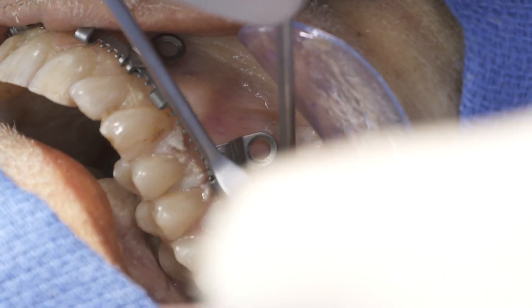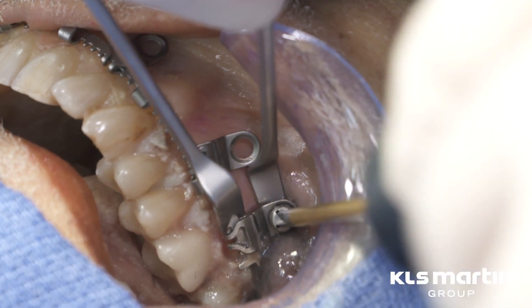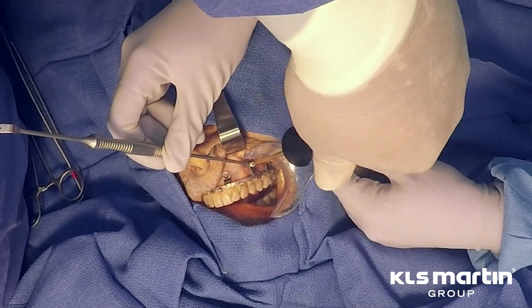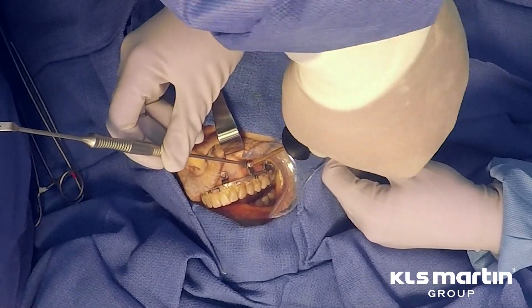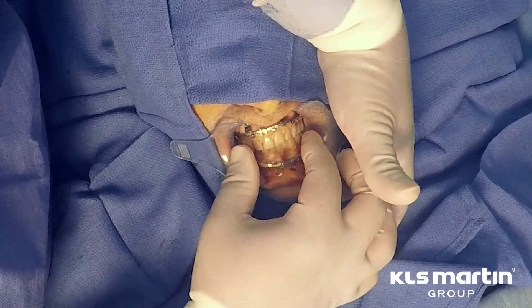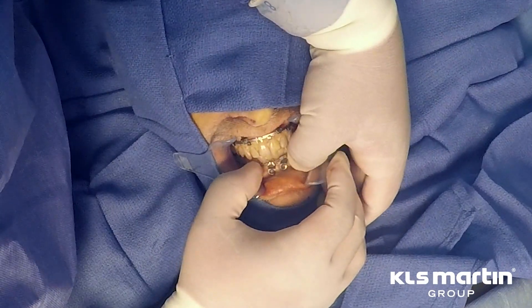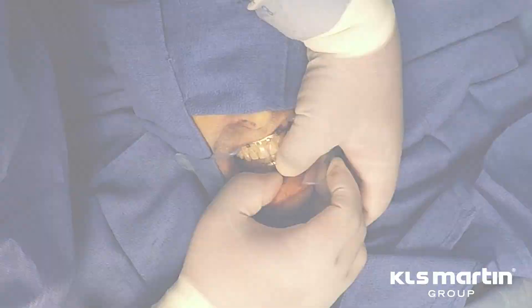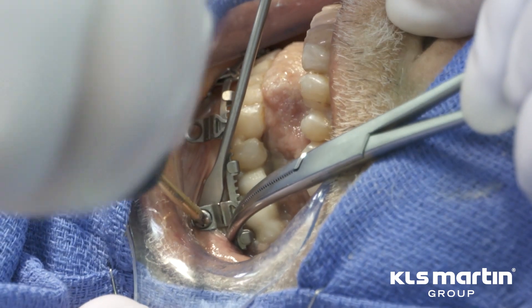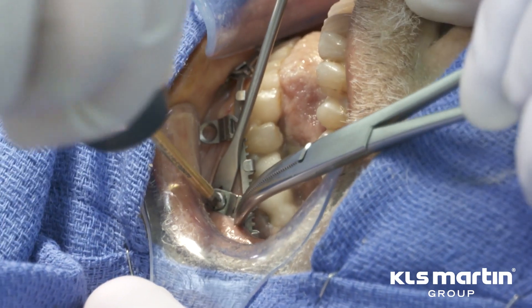In this situation, the surgeon elected to place the most posterior screw first, then fix the remaining screws between the midline and posterior. If this method is used, ensure that you maintain control of the arch bar curvature during fixation. When placing the L1 MMF system with the adjustable midline, such as in a situation with a fracture in the body area, working from posterior to anterior on the fractured side of the mandible ensures the area with limited fixation areas is secured first.